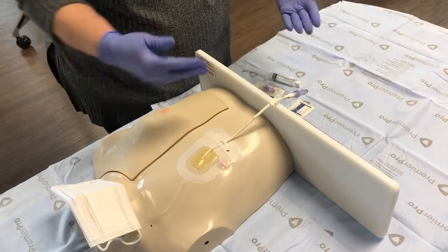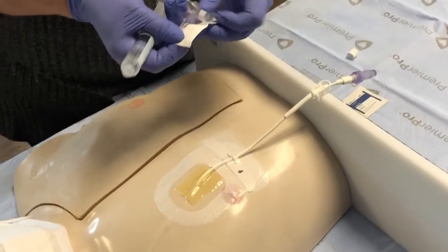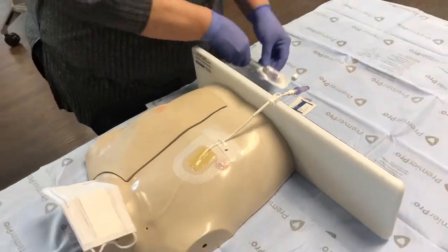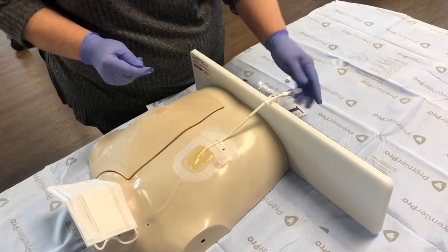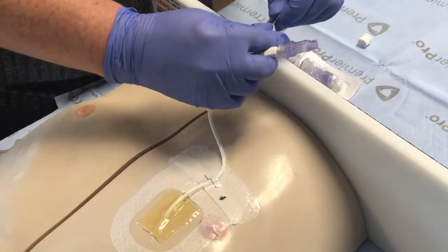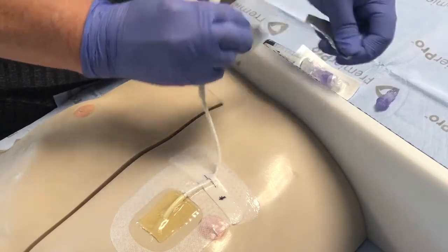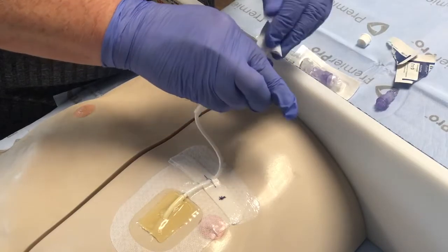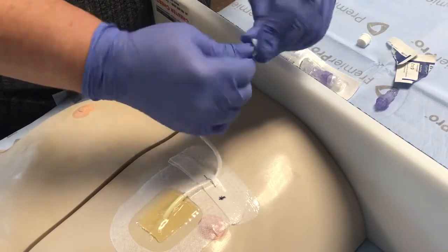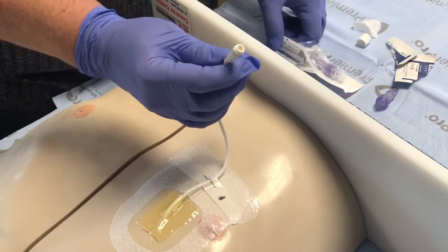Don new gloves and prime hubs for each catheter limb, keeping the saline syringe attached. Ensure that the catheter limbs are clamped. Remove one hub and scrub the bare catheter end with the antiseptic wipe of choice at your hospital for at least 15 seconds. Allow to air dry for at least 60 seconds.